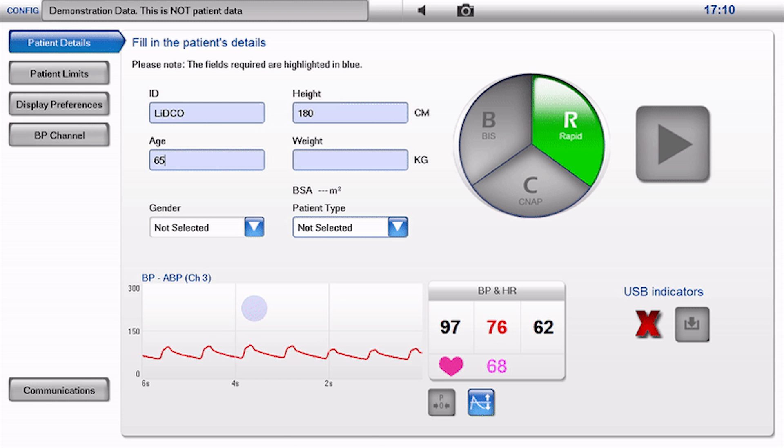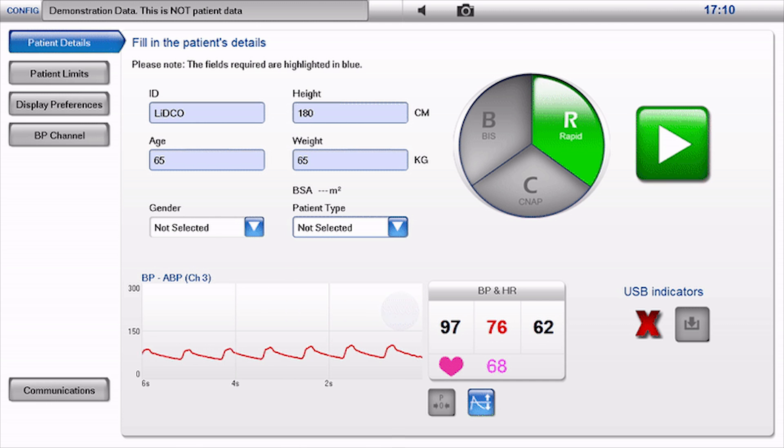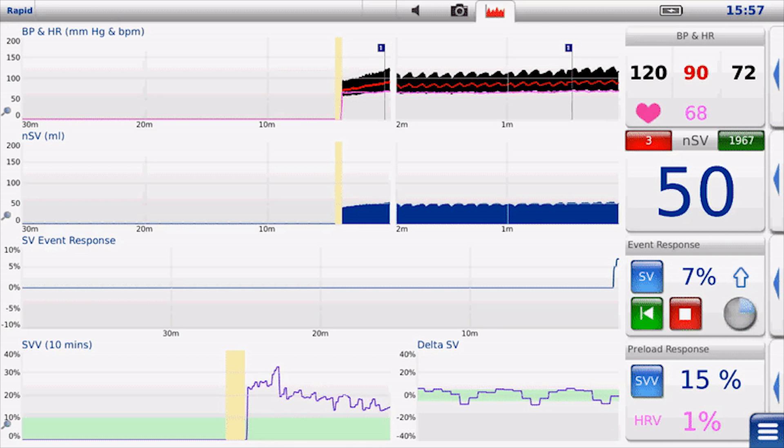Step 4: Enter patient details. Enter the patient ID number, age, height, weight, gender, and patient type. Press the green forward arrow to enter monitoring mode. If the arrow isn't green, go back to complete all details.